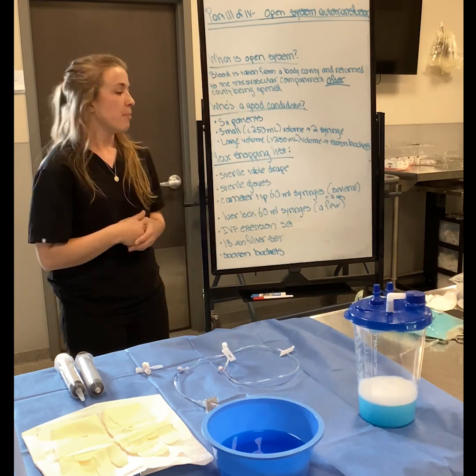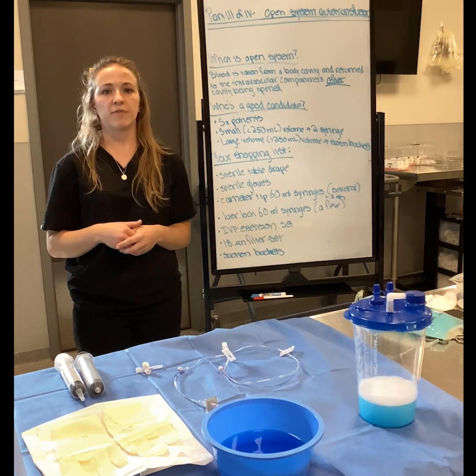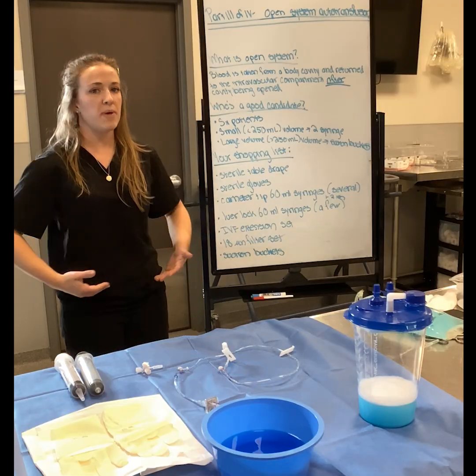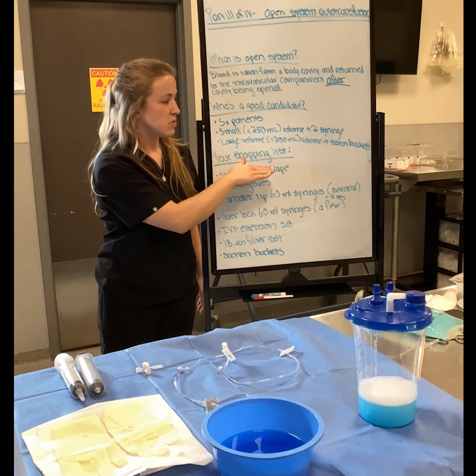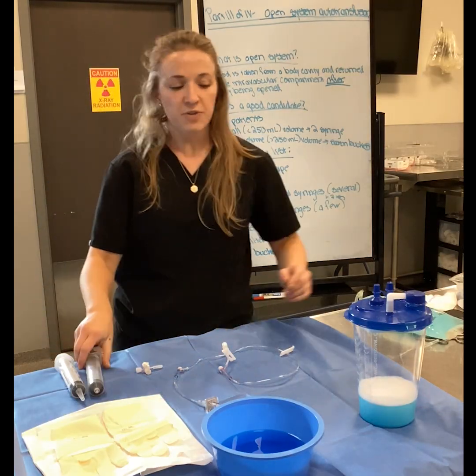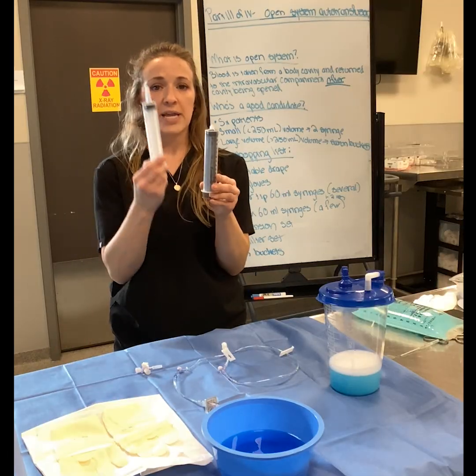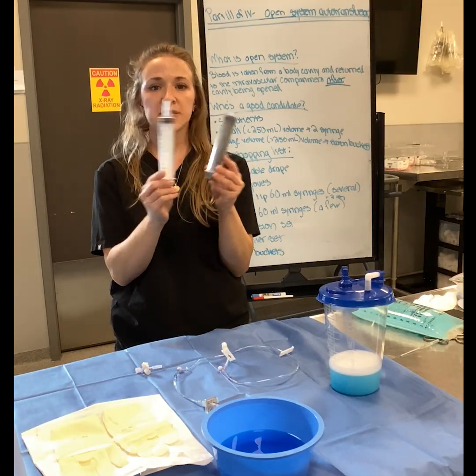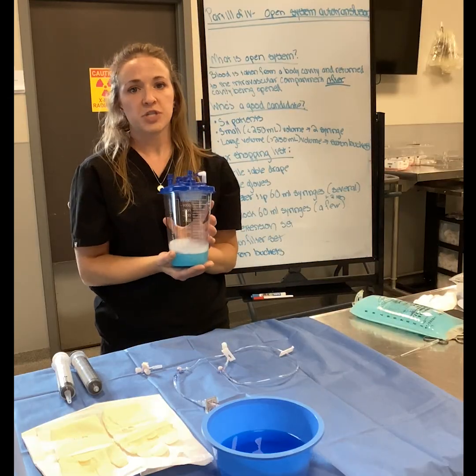But if your patient is much larger, if you have a really big dog, if you have a super traumatic injury, big distended belly or chest, this is when you're going to need to use the suction canisters in order to accomplish that. Because if you think about it, with the 2-syringe technique, we're going to put it into these syringes, so 60 mils is all it takes at one time. So that's good for a small patient.